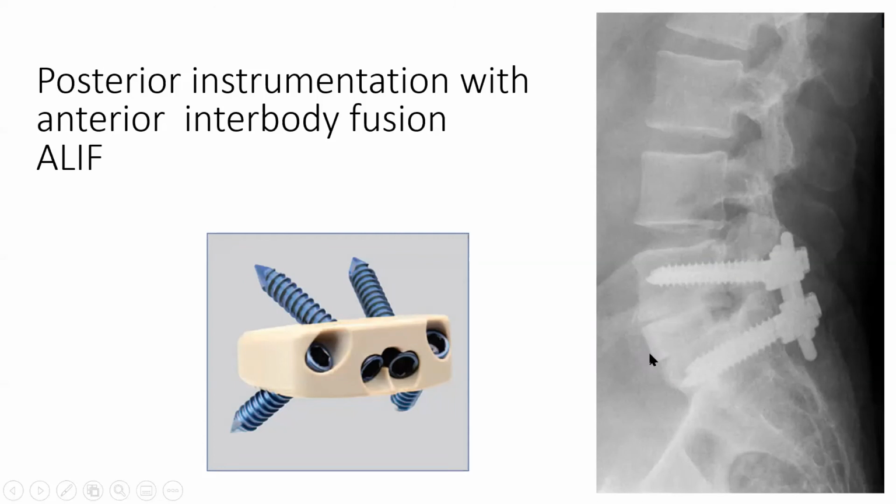This is actually a piece of femur. I think this patient might have had sepsis, but you can put a cage in. There's a cage there. It's a PEEK cage. Some of the cages have screws like this one, so it's designed to get a fusion here by going from the front only. Because of the screws, you don't need to put pedicle screws from behind. It's a standalone anterior cage, and it's called an ALIF, anterior lumbar interbody fusion. And yeah, so that's it.